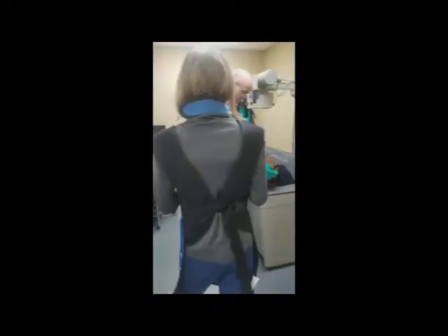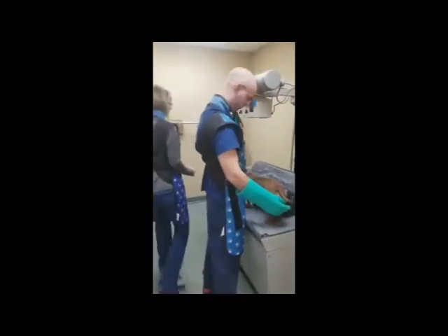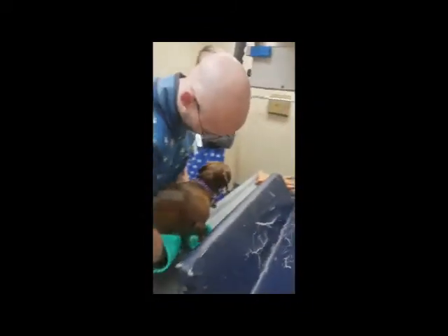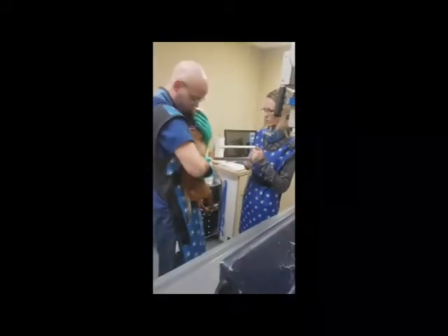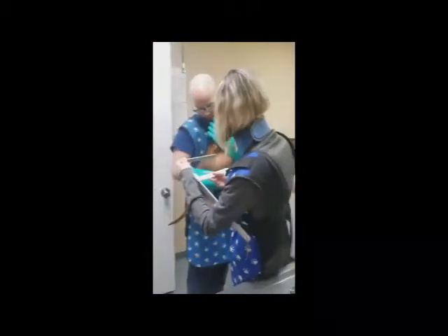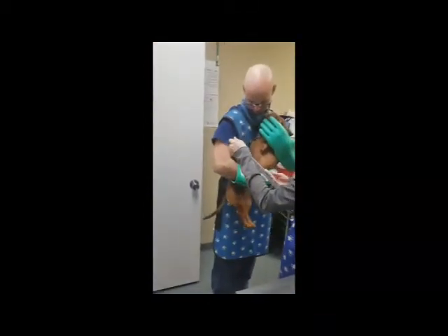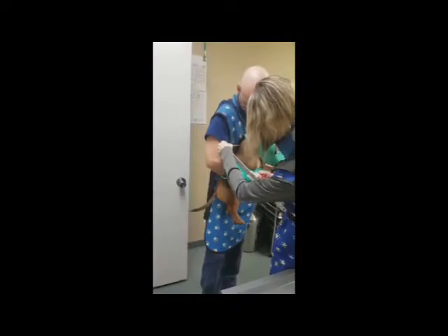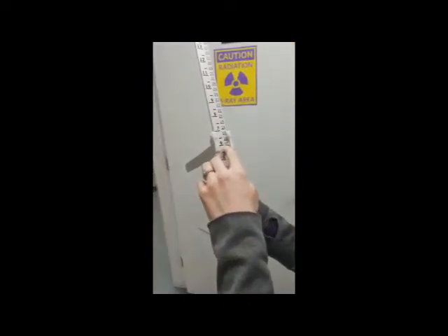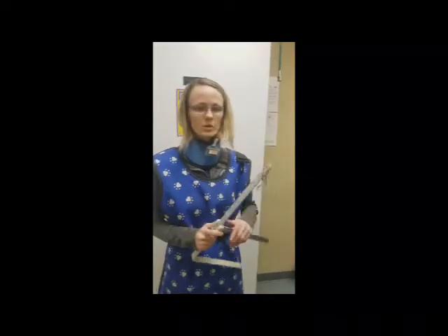Our machine doesn't require a caliper, but I'll show you how to measure a dog if you needed to. You want to measure at the thickest part of the dog's thorax to get the best measurement. Opening the caliper — it's 15 centimeters. There's a chart you would use if you needed to calibrate your KVPs and MAs from that measurement, but our machine does not require that.